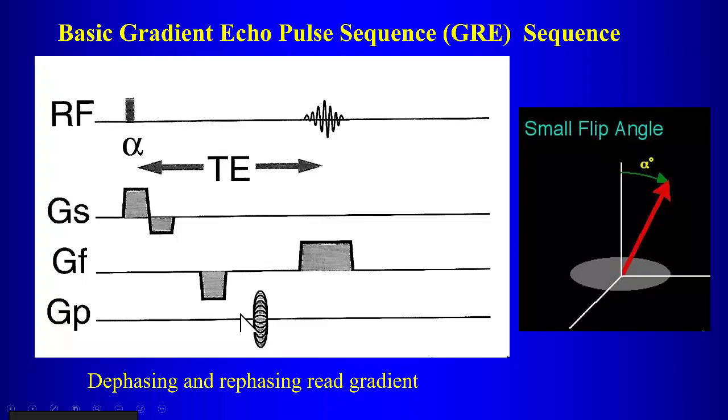Okay, to be able to recover the dephasing that is caused by the gradient, to both encode it and also not dephase it too much that you lose all your signal. But yeah, your read gradient when you're doing spin echo imaging also has to be properly placed so it doesn't counteract the gradient. But it's the rephasing component here, right, that's going to determine when your TE falls.